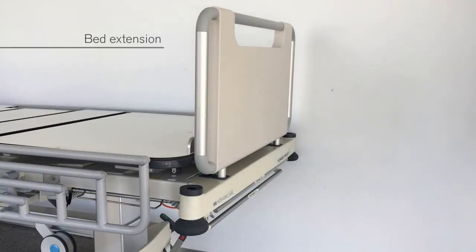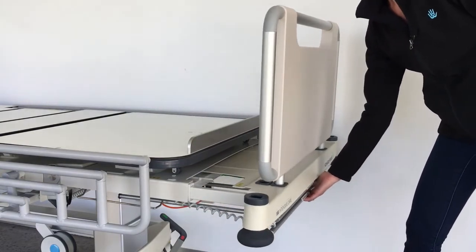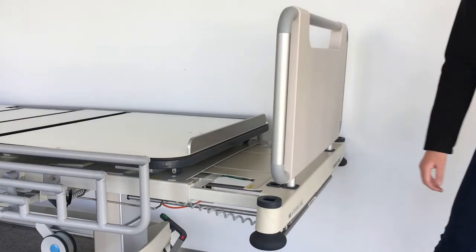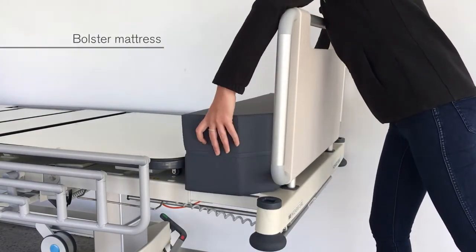A bed extension is located at the end of the bed and can be used for supporting the feet of a taller patient. To extend the bed extension, lift the release handle and pull the extension fully out and release the handle. Then place the bolster mattress on the bed extension.